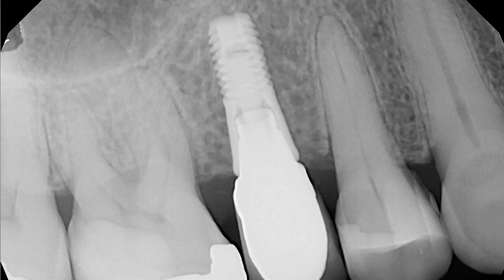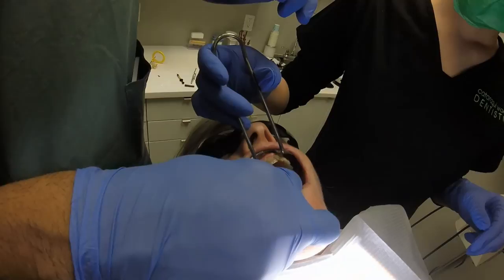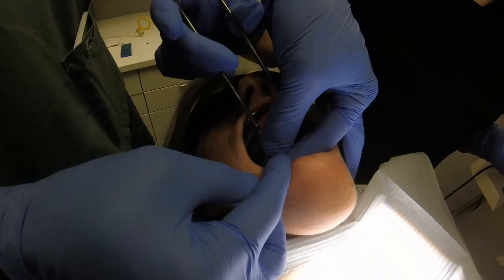In terms of occlusion, there are a number of things to check. The main thing is to ensure that the occlusion is light on the actual implant. You want the patient to bite down nice and hard to compress the periodontal ligament of the other teeth, to ensure that just because it's light when they bite lightly, you don't suddenly have heavy occlusion on the implant when they bite heavily, because the implant isn't going to like that. More importantly, check the patient in lateral excursions to ensure that there are no non-working interferences. We'll move to a little video now.